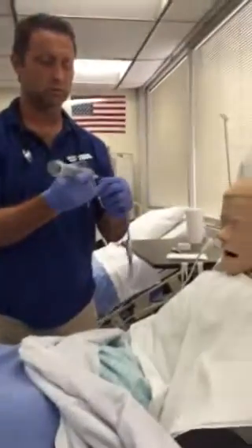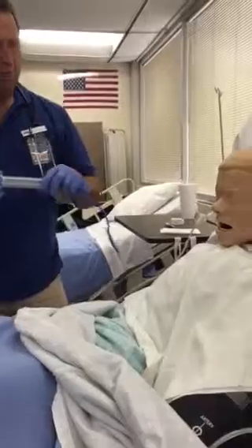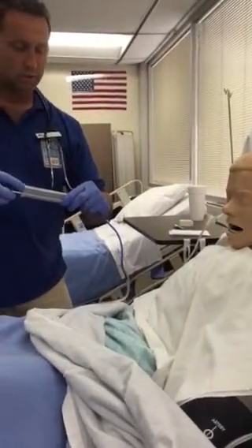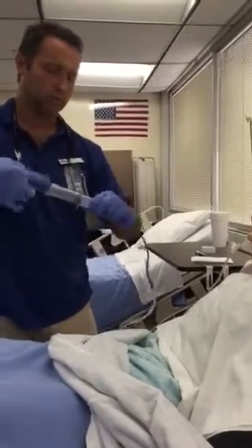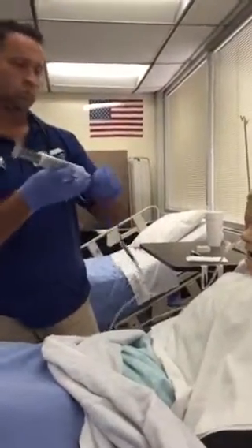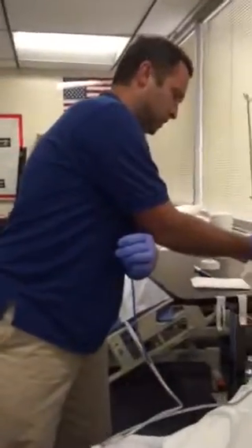We're going to take our 60 milliliter syringe, stick it here. Now what I'm going to do is aspirate for stomach contents. I'm going to aspirate, and look at that, I got some stomach contents back. Okay, so here's what we're going to do. I'm going to disconnect. We're going to put a little bit of the stomach contents into a little cup.